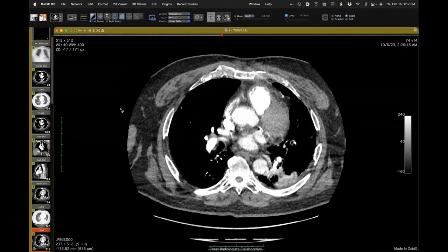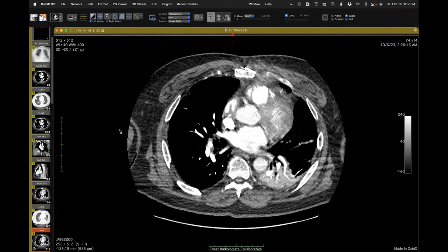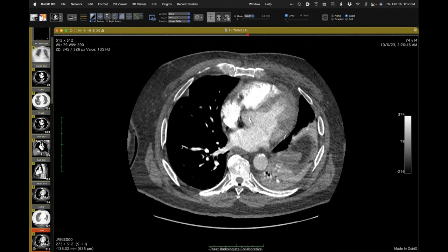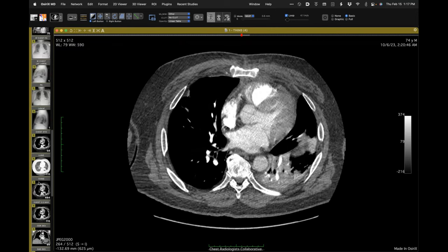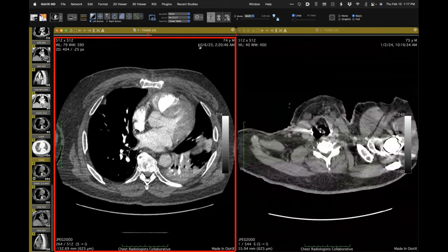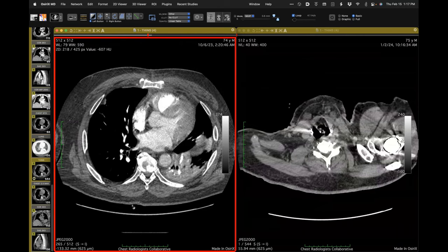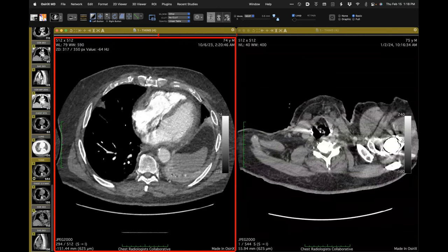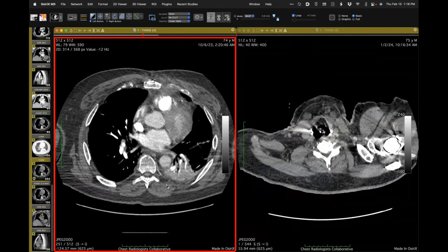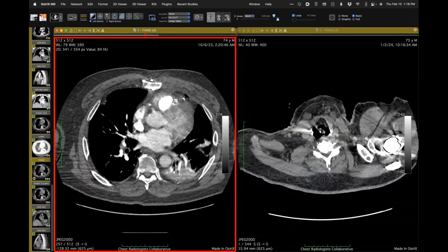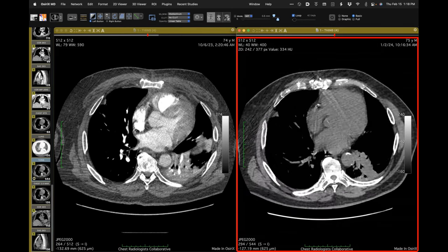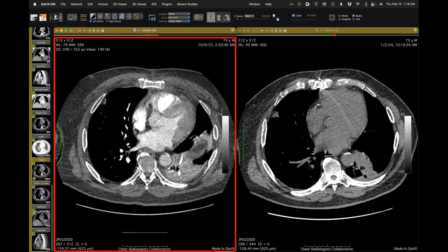Looking at a CT from October alongside the most recent non-contrast study from January: this opacity is very nicely enhancing lung, typical of atelectatic but not consolidated lung. Vessels are close together with some air in the bronchi. So yes, it's persistent, but it is atelectatic lung, not consolidated lung.